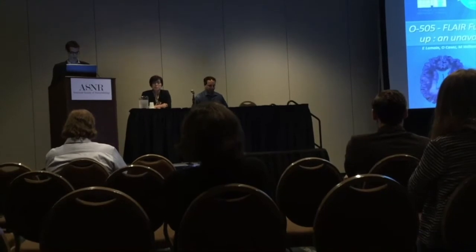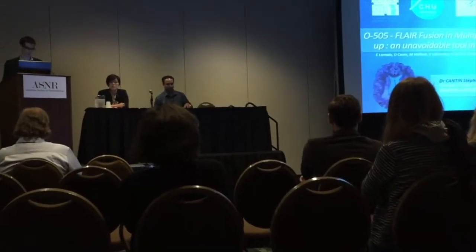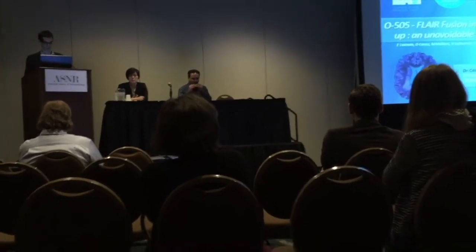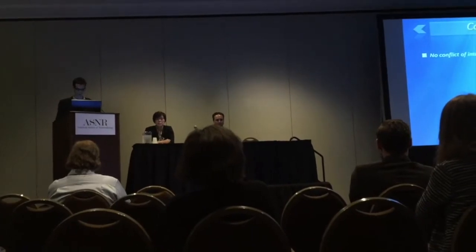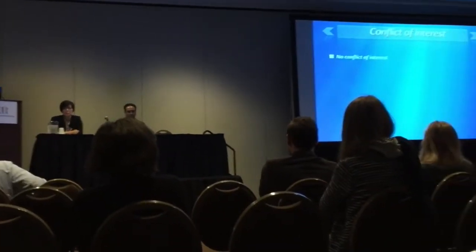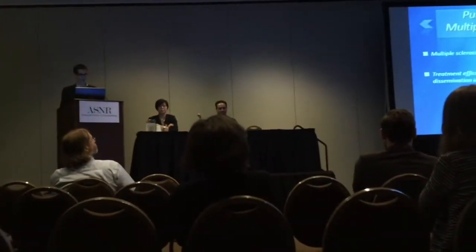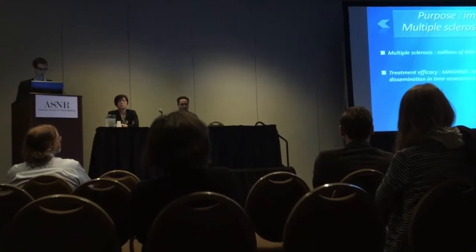The goal of this presentation is to underline the benefits of FLAIR fusion analysis in private practice when following MS patients. None of the authors has any conflict of interest, and this study has been conducted in a private practice center.